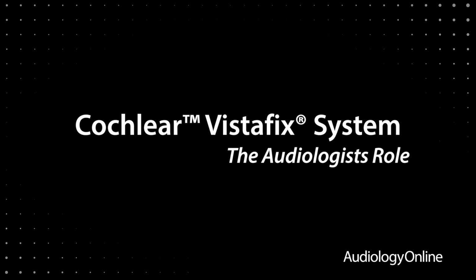So the biggest benefit for audiologists being involved in the whole process of the Vistafix procedure, whether that's initial counseling or all the way through the final fitting, is really particularly for patients with the congenital malformations. The microtia atresia patients often have that conductive hearing loss element, and that's why we often see a Vistafix procedure being performed in conjunction with a Baha procedure. We want to make sure that the audiology community is aware of this as another alternative, particularly as patients get to a certain age where they may become more self-conscious.